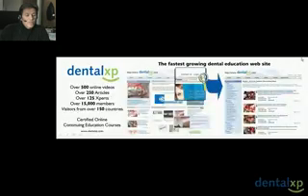I'll take another question. Is it possible to use a CEREC for a temporary restoration? This is from Italy. Yes, as a matter of fact, CEREC and CAD/CAM technology is something we've been working on, and it absolutely can be utilized. You can pre-scan these abutments with a CEREC machine, store it in its database, and then scan in the mouth once the abutment is inserted, and have a CEREC fabricated as a temporary or even a final restoration. So absolutely it can be done with any system: pre-scanning of the abutments and storing it on the computer. We've been doing that, and we've been very happy with some of the early cases.